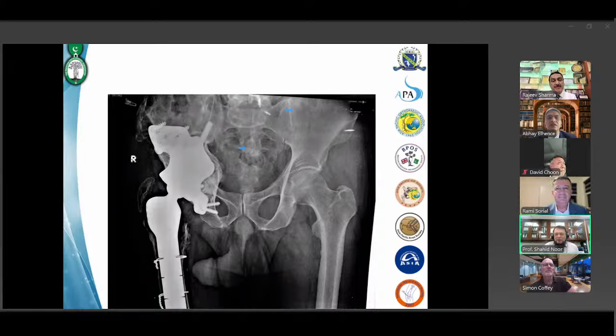You need to have a biological restoration. The modes of failure are dislocation and failure of fixation. So you need to involve strategies to prevent failure of fixation, and you need to have a strategy for failure of dislocation. Thank you. And Deepak, quick word. So short stem specifically, it is going to come back. The short stem is going to come back. Great. Perfect.